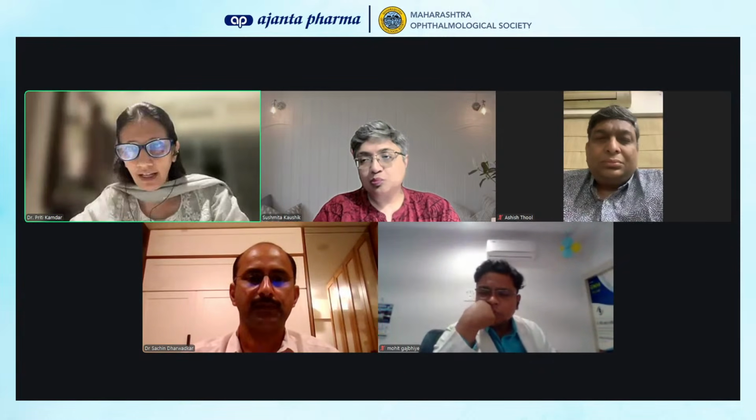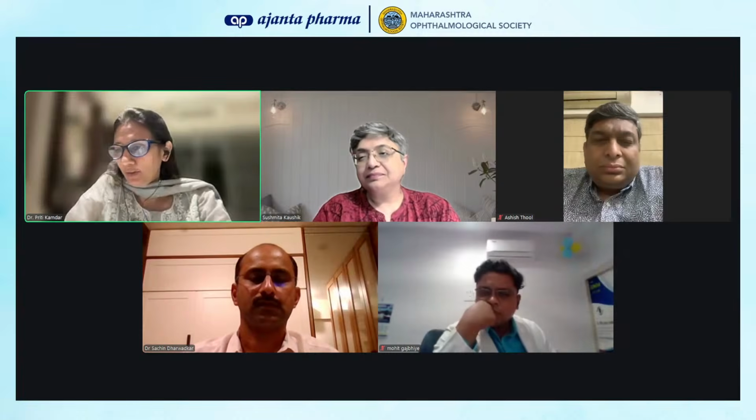As simple as that. It will affect your fundus photographs, which will not be able to focus, and it will also affect your imaging. So please do not introduce these kind of irregularities in a compromised eye. So that's the answer. If it's definite glaucoma, definitely no trifocals. All right. So that's one thing.